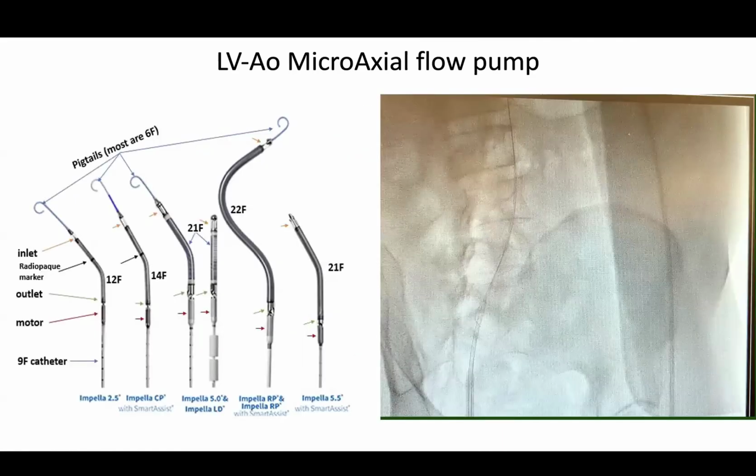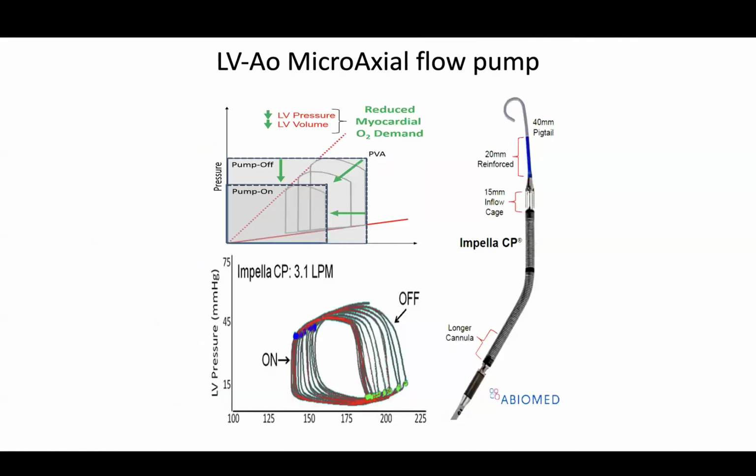And then the 5.5, it's a 21 French, surgically implanted for now, using a graft and subclavian access. Some of the hemodynamic effects of these pumps.